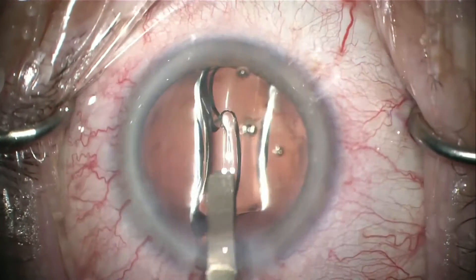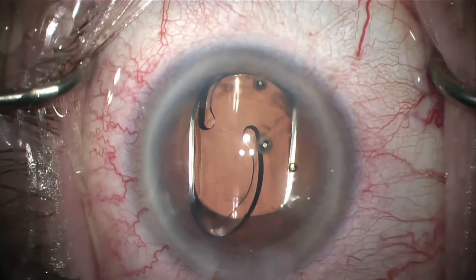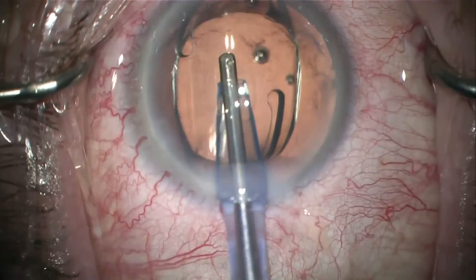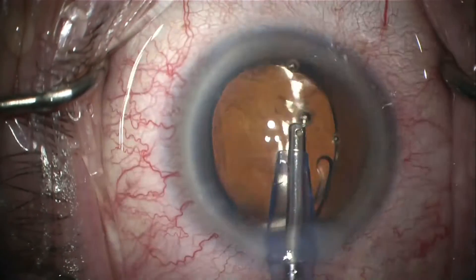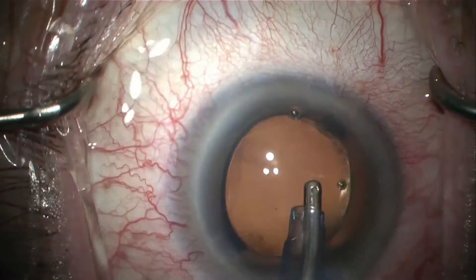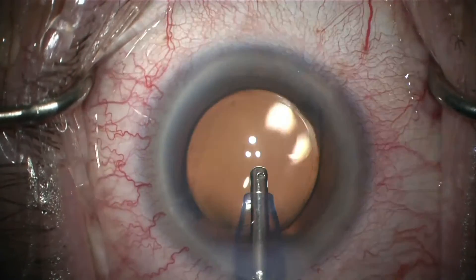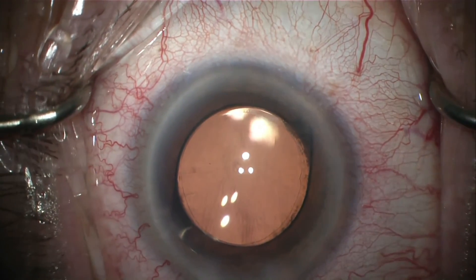The lens is easily inserted and very slowly unfolds in a controlled fashion. It is a 6mm aspheric optic, and once the viscoelastic is removed it will achieve excellent centration, minimal tilt. With overlap achieved by the capsulorrhexis margin, it will have excellent long-term refractive stability and minimal PCO for excellent visual outcomes.